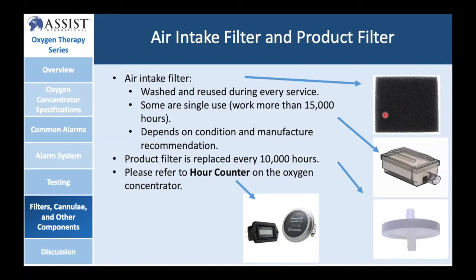There are other filters in there, for example, the product filter that is inside the device itself. This needs to be replaced every 10,000 hours. Again, you need to reference the service manuals to see exactly what the manufacturer would recommend. Our recommendation is that you switch these out every 10,000 hours.